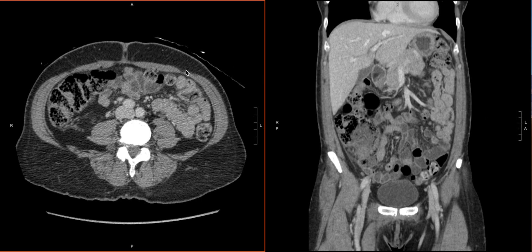I have my axial series here and my coronal. These are really going to be our workhorses. Sometimes you may use sagittal as well, but for many cases, these two are going to give you everything that you need to be able to make the diagnosis.